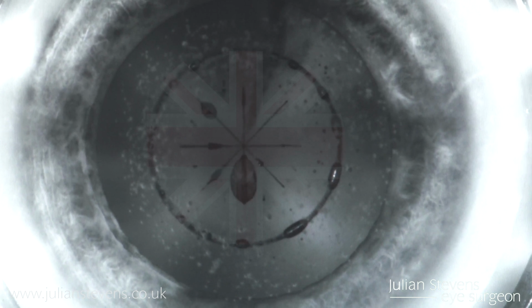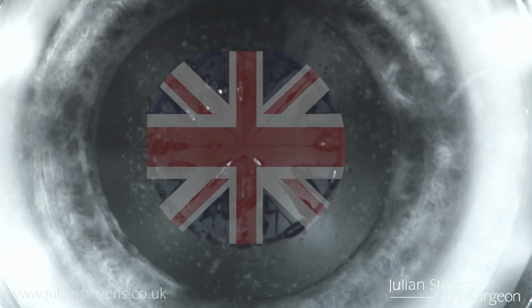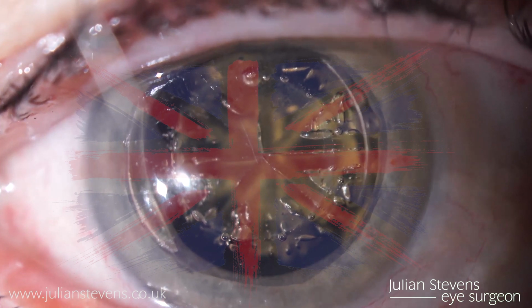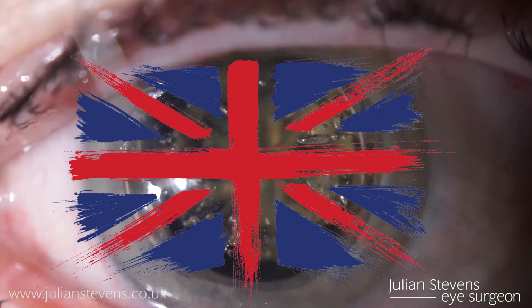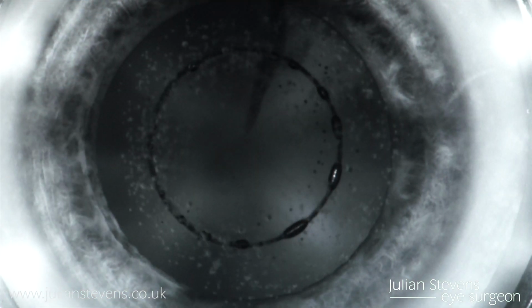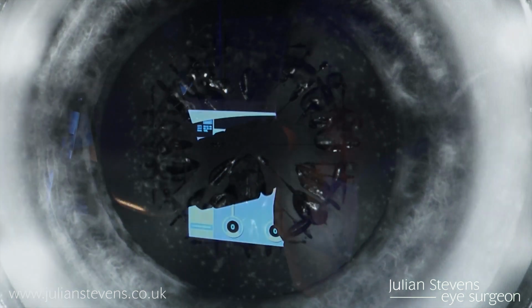I designed this with Optimedica in Silicon Valley to be one of the most efficient configurations for cataract surgery. Here you can see the Union Jack design being created as the laser outline is directed to the lens. This Union Jack pattern is used by myself, other surgeons in the UK, and also surgeons in the United States and around the world who are also sculpting the Union Jack for their patients.